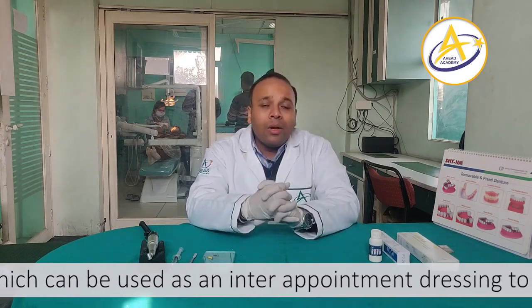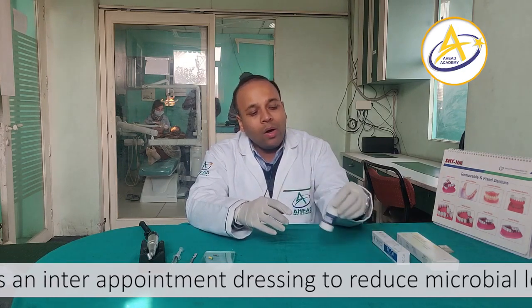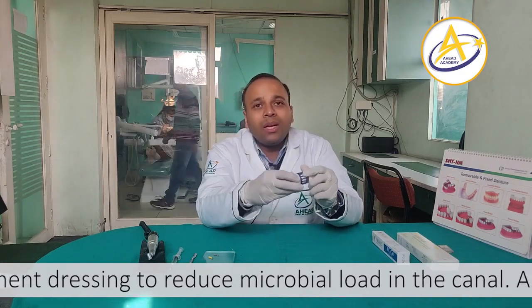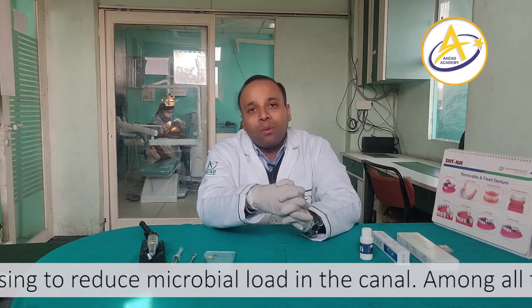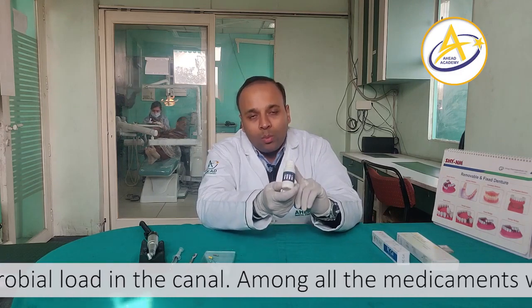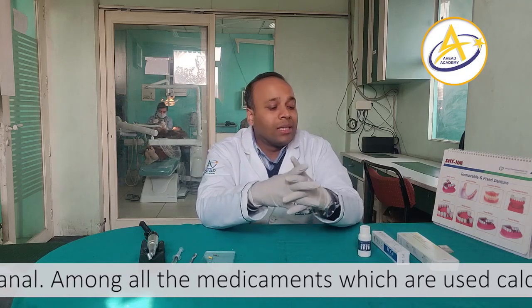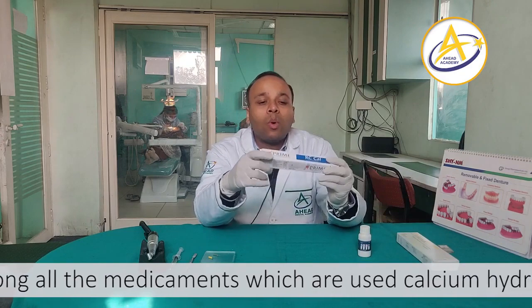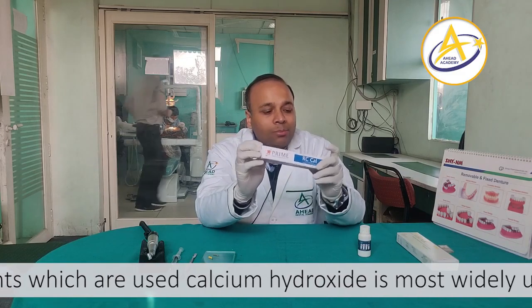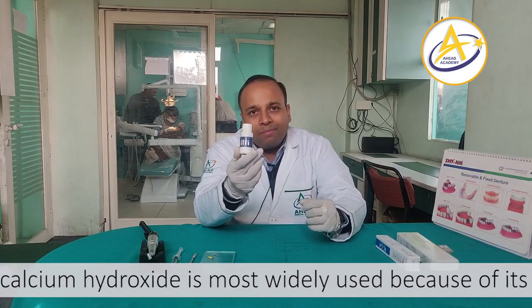Calcium hydroxide normally comes in powder form — right now I have the powder form, which consists of a white color powder. There is also a pre-mixed calcium hydroxide form, meaning calcium hydroxide already mixed with distilled water. The powder form needs to be mixed with distilled water before putting it in the canal, whereas the pre-mixed form is already done. Putting the pre-mixed form in the canal is very easy, whereas the powder form is comparatively more cumbersome.